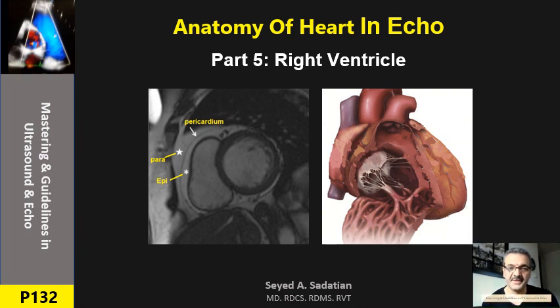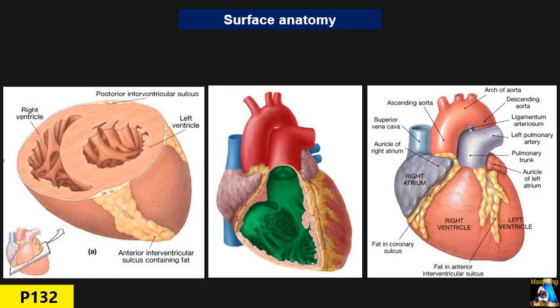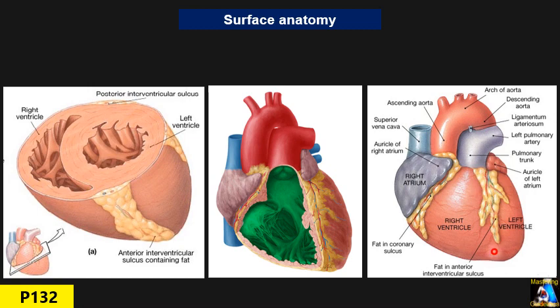Welcome to Mastering Guidelines in Ultrasound and Echo. The right ventricle is the most anterior chamber of the heart — right behind the sternum. It occupies almost two-thirds of the anterior area of the heart. The left ventricle occupies one-third, limited by the interventricular groove and atrioventricular groove. The RV shape is completely unique: in the long-axis four-chamber view, it is triangular, opposite to the left ventricle which is bullet or cone shaped.